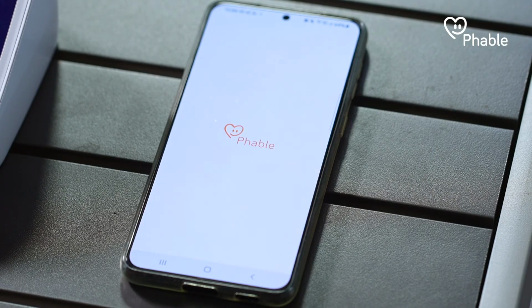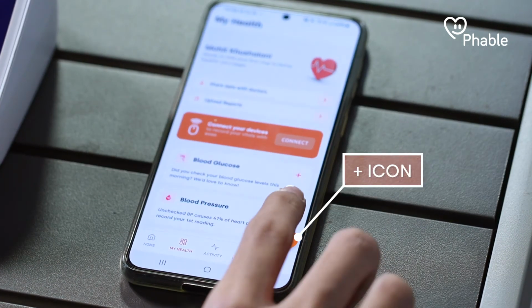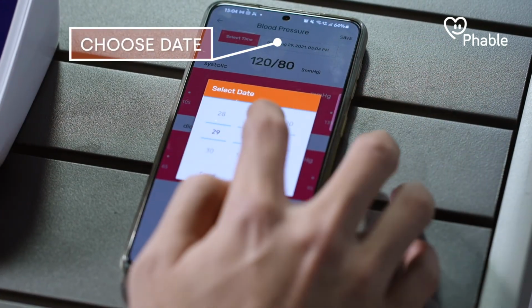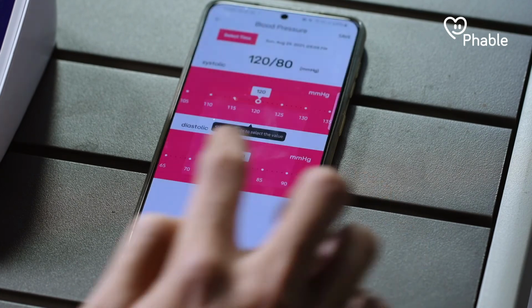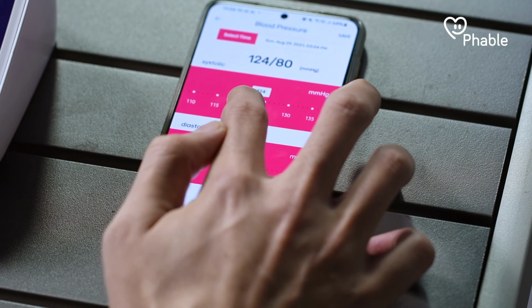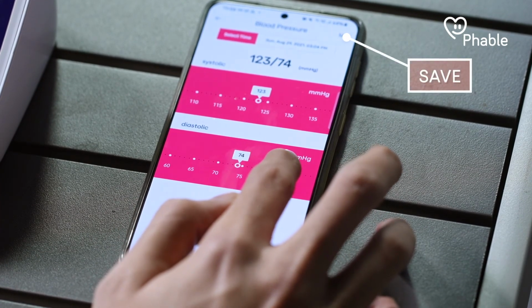It is very easy to pair your Omron BP monitor with the Phable app. Open the Phable app and tap on the My Health tab located in the bottom menu. Tap on the plus icon next to blood pressure and you will see a new screen with a BP measuring scale. Now, choose the date and time, record the systolic and diastolic BP values from your Omron device and click on Save on the top right of your screen.